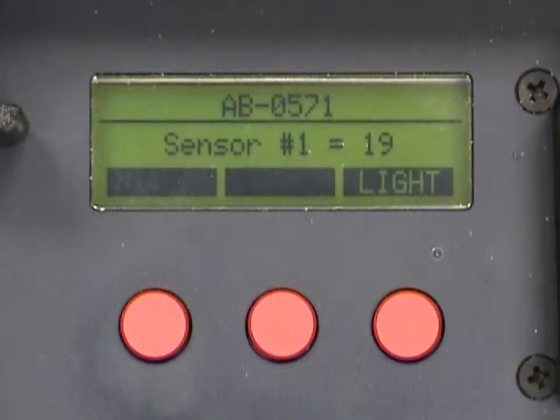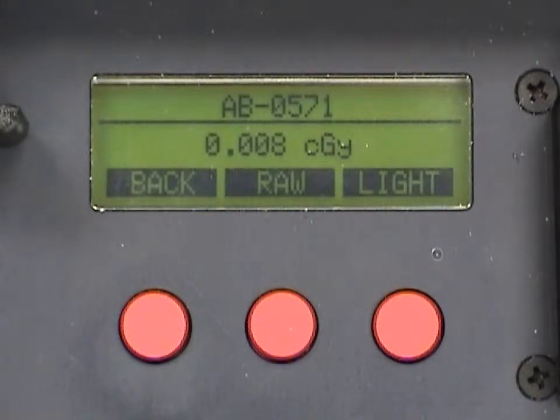As the reader is reading the dosimeter, the display will show the dosimeter serial number at the top. As each sensor is read, the RadLite display will show the sensor number along with its associated reading. After all sensors are read, a total dose is calculated and displayed.